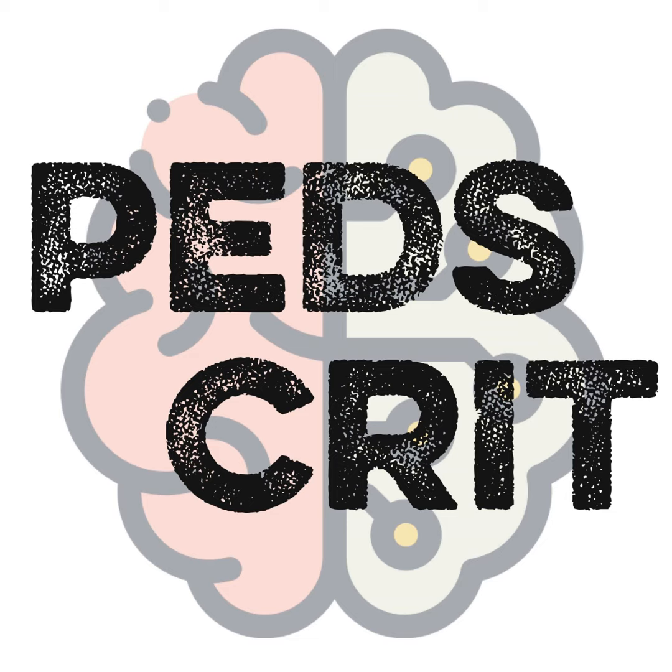We need dedicated pediatric devices. We need appropriate pediatric-sized catheters that are also pliable and not as thrombogenic as the current catheters we have. We need better anticoagulation techniques that are not citrate but regional.